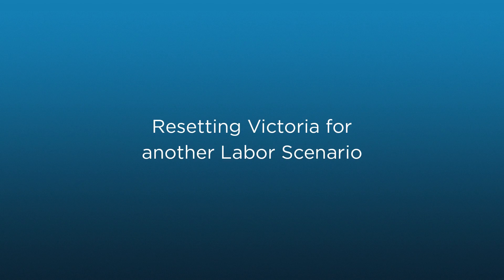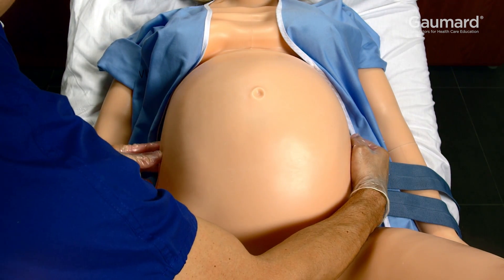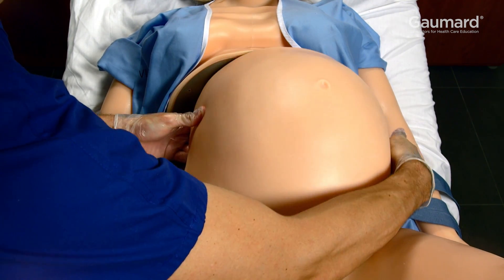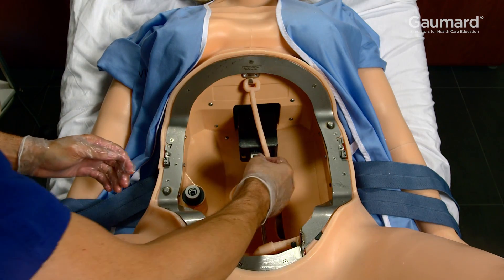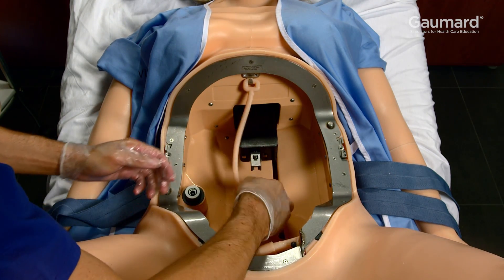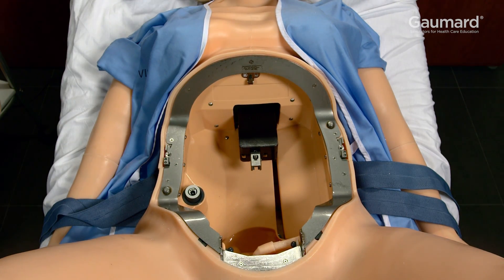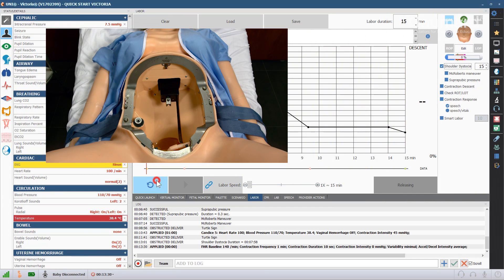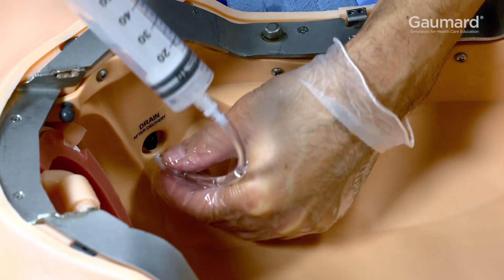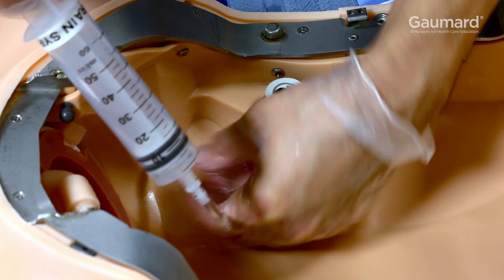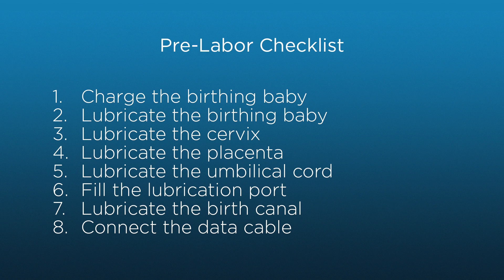Once the scenario has ended, resetting for the next scenario is easy. Do not attempt to lift the contractions cover without first releasing both latches. Press the release sledge and gently lift the cover enough to disconnect the data cable, then remove the cover. Remove the birthing rod from the motor by pressing the lever and remove the birthing ring from the retaining hook. Press the reset button in the software to return the motor to a starting position. Once the motor has returned to the starting position, use the drain syringe to pull the mineral oil and simulated blood from the drain port. Victoria is now ready to perform another birth. Prepare the birth, making sure to complete the pre-birth checklists.